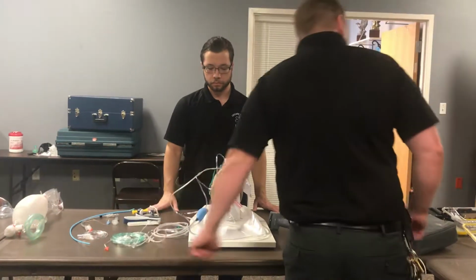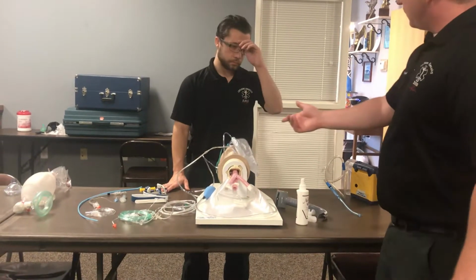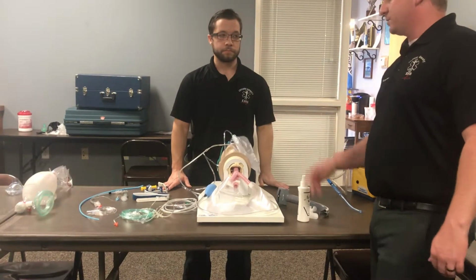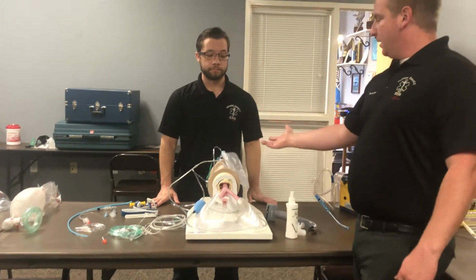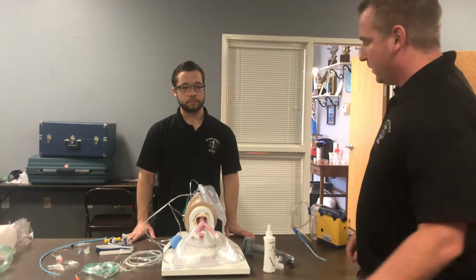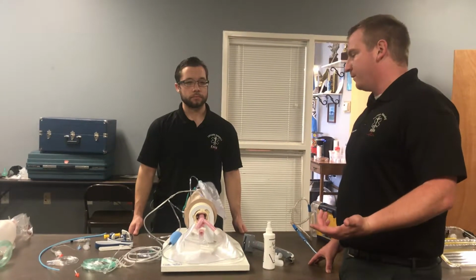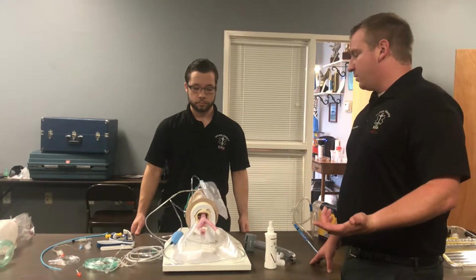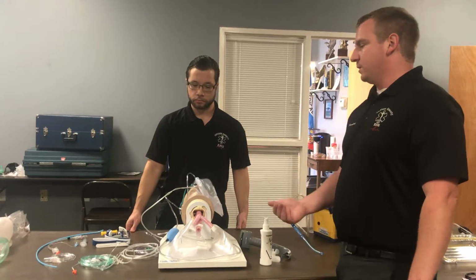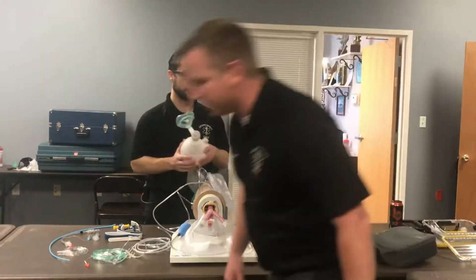Alright, so Levi has now got the nasal cannula on the patient. He's got the nasal cannula at 6. He's got the non-rebreather up to its rate, 10, 15. IV has been established. We have decided that we now need to ventilate for the patient. So IV has been established. Levi is going to give ketamine, rocuronium. So that has been given.